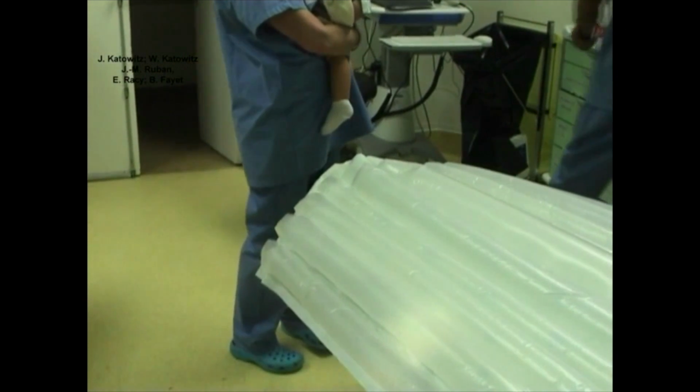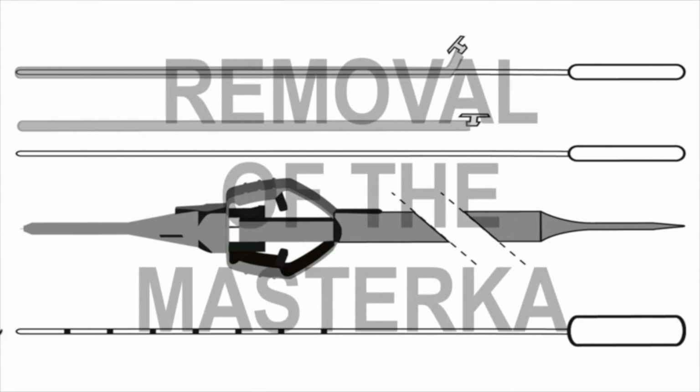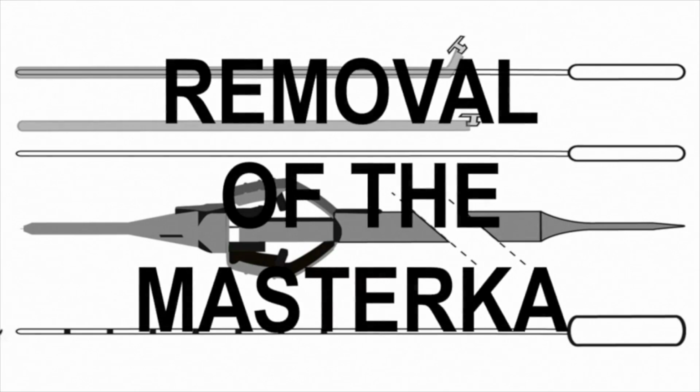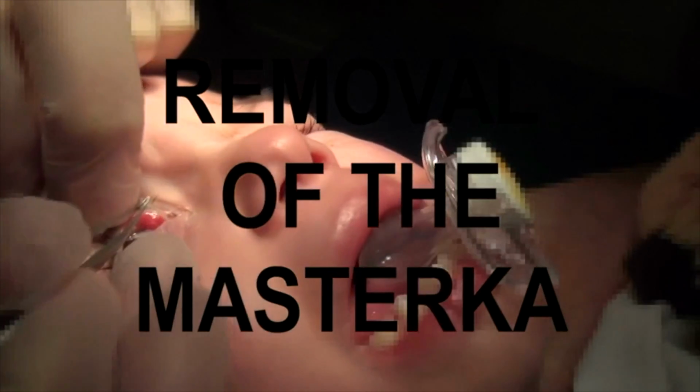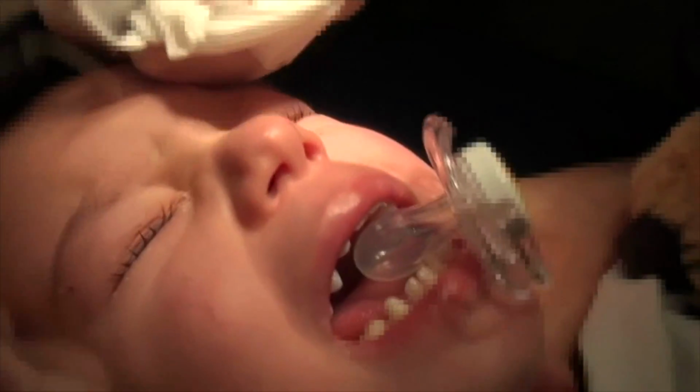With the MASTERKA push technique, the patient will wake up much more quickly and postoperative monitoring will be shorter than after a pulled intubation, which improves the overall surgical experience. Removal of the MASTERKA can be done as early as 1 month postoperatively. This is done as a simple office procedure using forceps to grasp the fixation head.